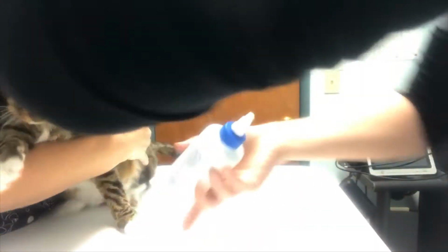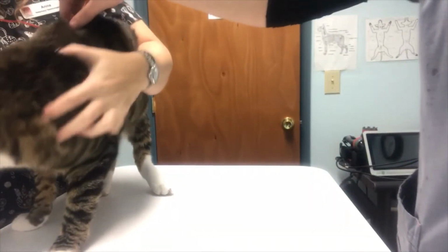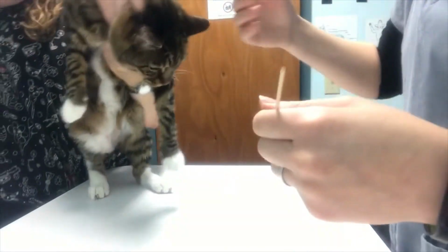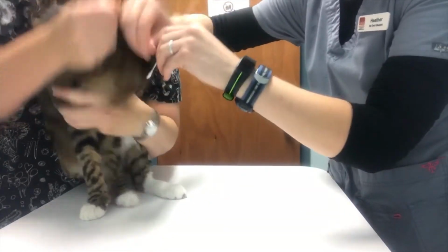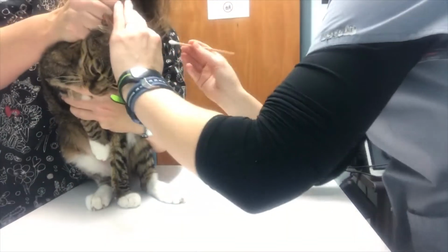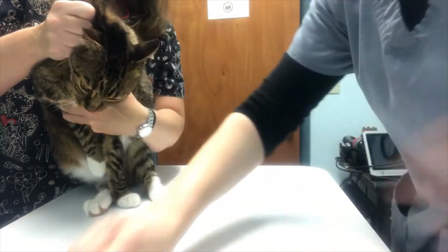Use a little Epiotic in. Gently squish. Hey buddy, okay. Sometimes them shaking their heads can help loosen any of the debris that the Epiotic has loosened. Take a cotton swab. I know, buddy. Okay. Swirl around to get any debris out.